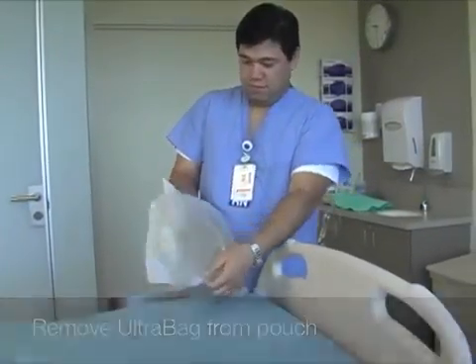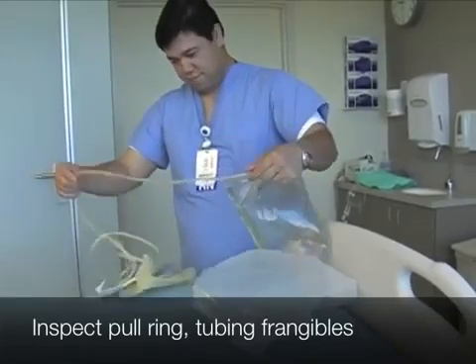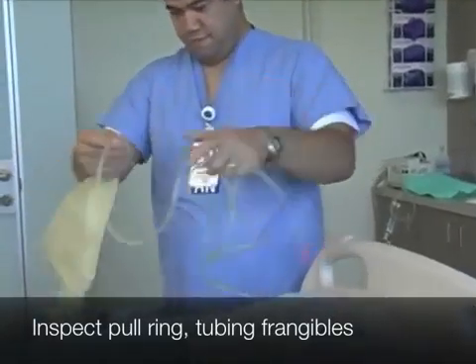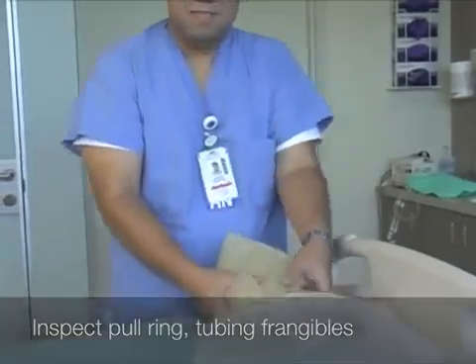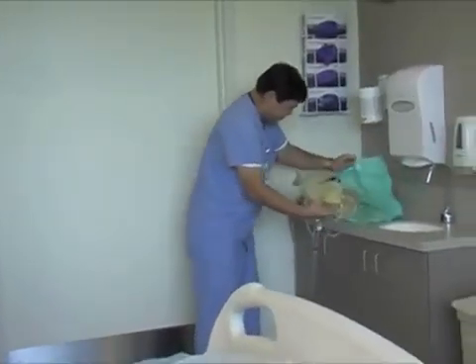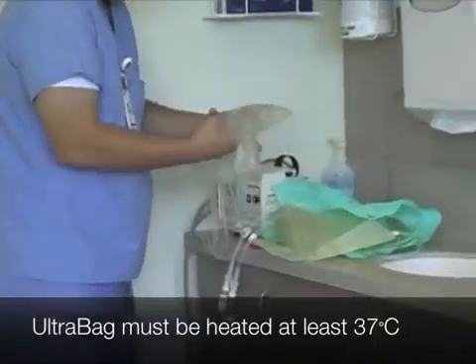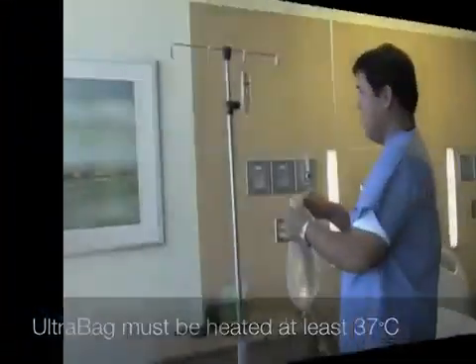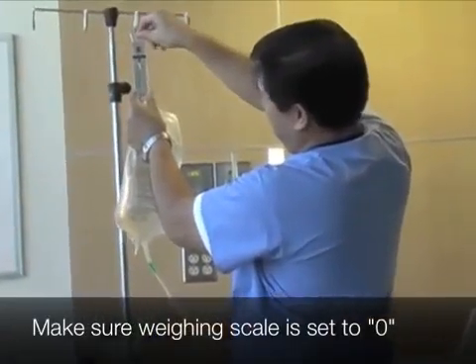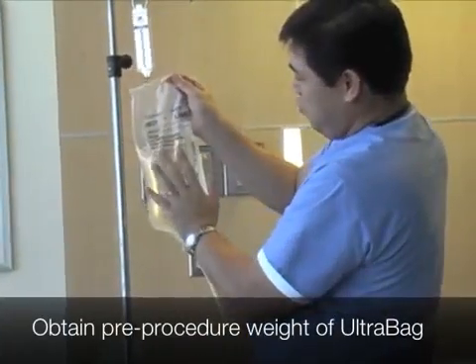Remove ultra bag from the pouch. Inspect the pull ring, tubing frangibles, and new solution bag for micro leaks. Make sure the ultra bag must be heated at least 37 degrees Celsius. Make sure the weigh scale is set to 0 by pulling up or down on the top. Hang the new solution bag on the weighing scale to get the pre-procedure weight. Exclude the weight of the drain bag.